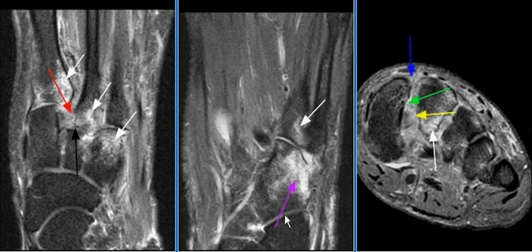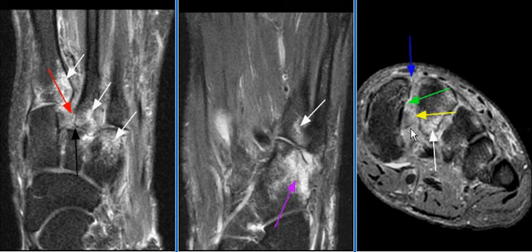A 25-year-old with history of trauma complained of foot pain. MRI examination shows complete disruption of the Lisfranc ligament, including the dorsal, the interosseous, and the plantar components of the Lisfranc ligament are torn.